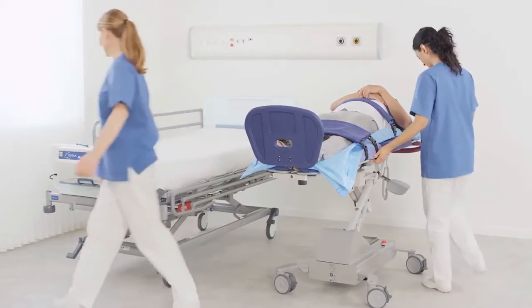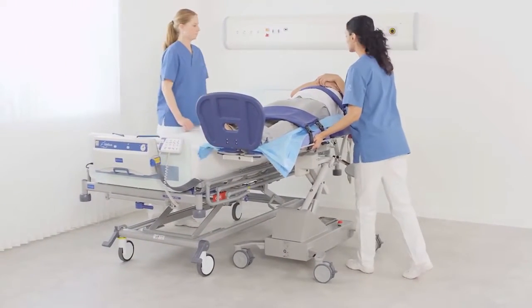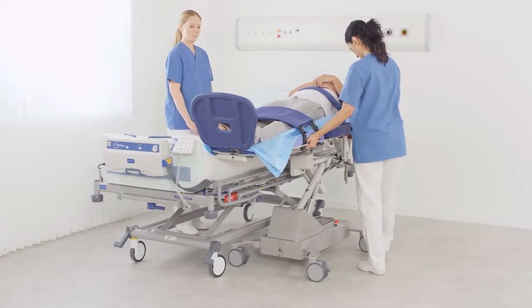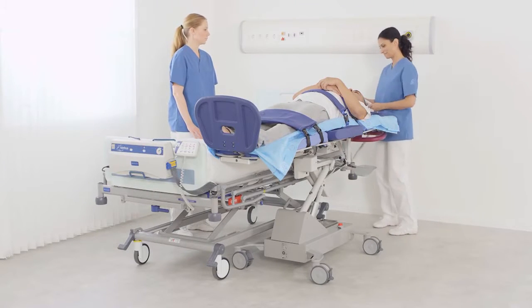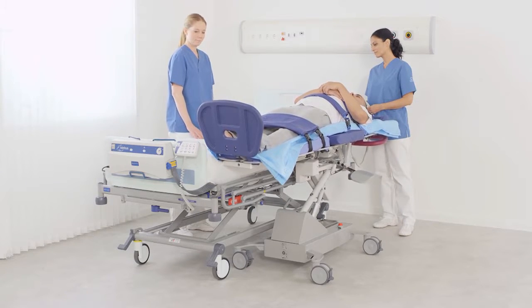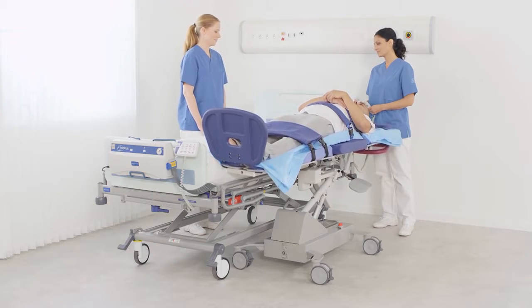Gently tap the brakes to release them. Position Sara Combilizer parallel to the bed with a slight overlap over the mattress. Tap the brakes to apply them. Using the hand control, lower Sara Combilizer so its edge is on top of the bed edge. It should be slightly higher than the mattress to ensure an even transfer.